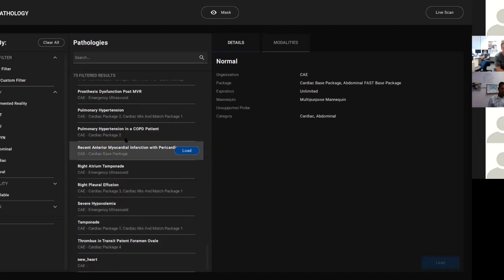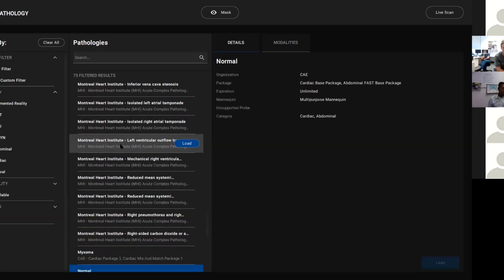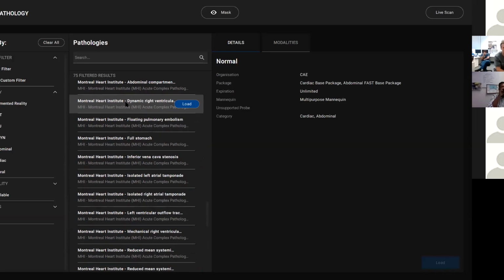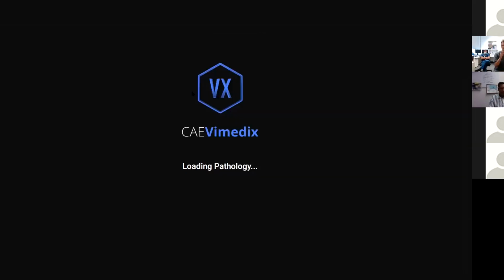Yes, Sam, can I ask a question? This is Sid from Darwin. Hi, buddy. When we are doing the pulse wave Doppler, say in apical 4 chamber at the pulmonary veins, sometimes multiple gates appear. How do you get rid of multiple gates? Yeah, absolutely. I'm just going to load this up and I'll try and explain that.